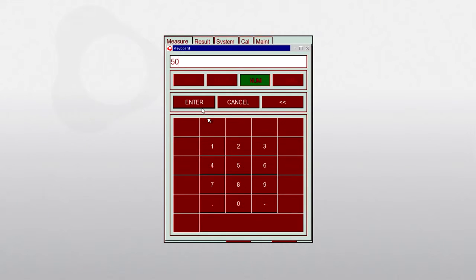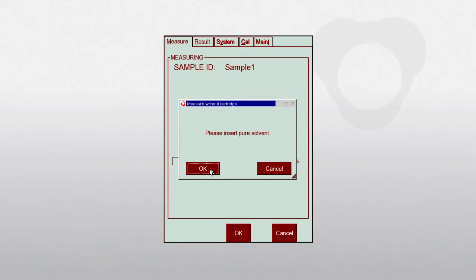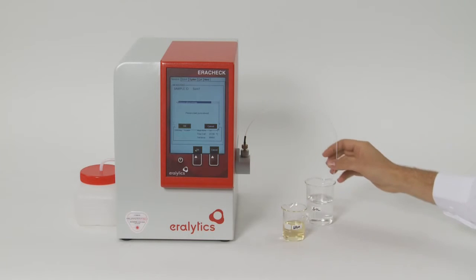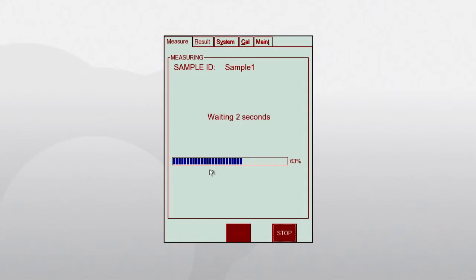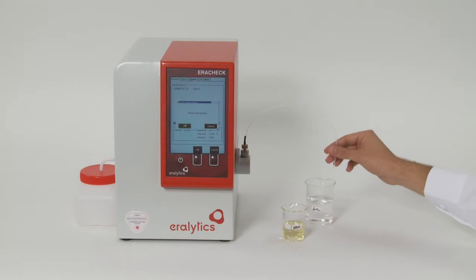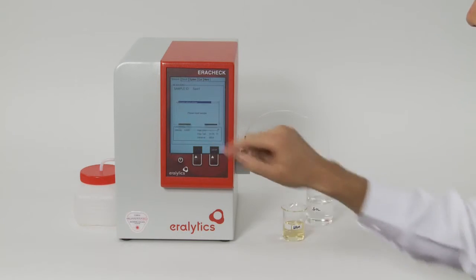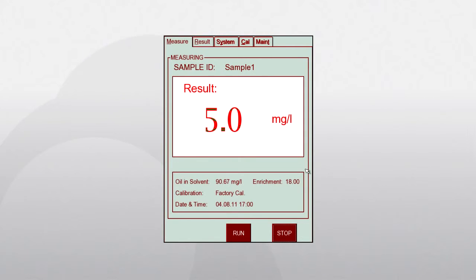To measure the total oil and grease concentration, select factory calibration or your own customized calibration and press run. You will first be asked to insert pure solvent — make sure to take it from the same solvent batch used for the actual extraction. After the measurement of the solvent, wipe the filling tube with a tissue, put it into the extracted sample, and confirm on the display. The analysis finishes within two minutes, and the displayed result is the concentration of oil and grease in water, measured in milligrams per liter.